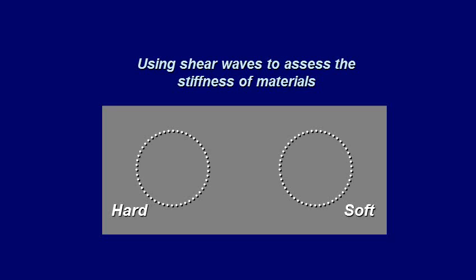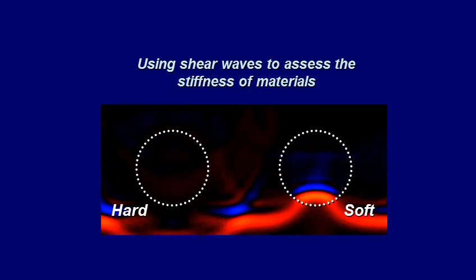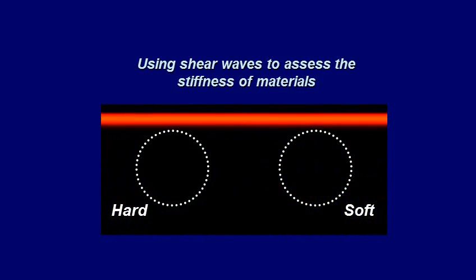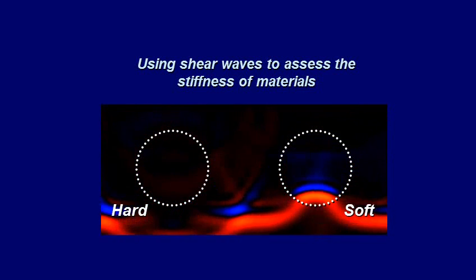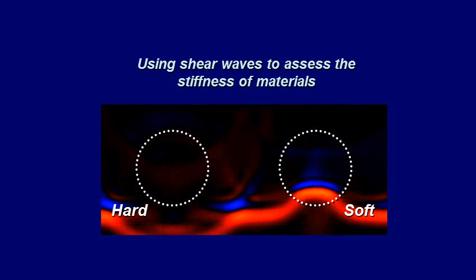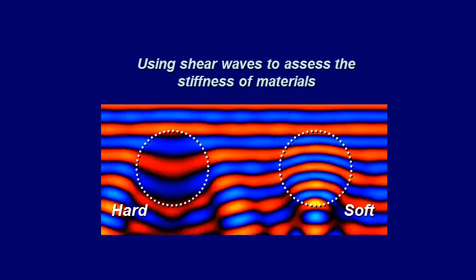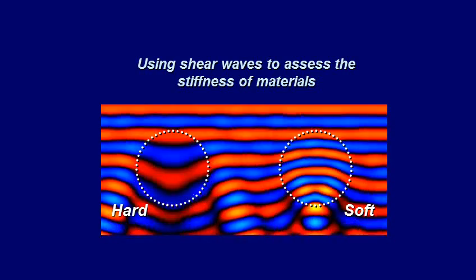Magnetic resonance elastography works on the principle that propagating mechanical waves move more rapidly in stiff material than in soft material. The basic idea is to generate mechanical waves in the body and to track the waves as they pass through various structures. If you could measure the speed of the wave in various regions, it would reflect the local mechanical properties. And if you were to apply continuous waves, like you see here, then the speed is reflected as the wavelength, which is longer in stiffer areas and shorter in softer materials.